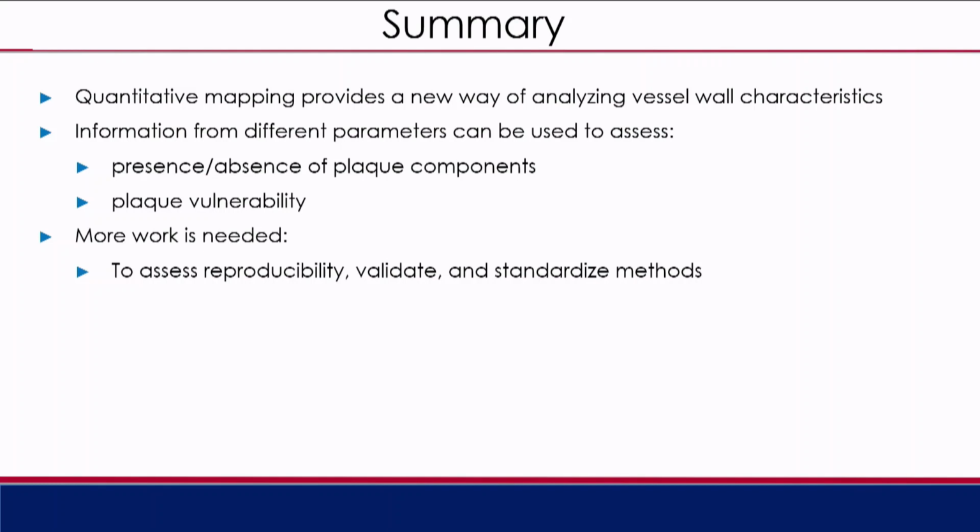The hope here is that you would have a technique that will acquire data that's quantitative. You can automatically segment the wall, or there will be a software that will do it and can actually classify the plaques without really the need of these very experienced radiologists to do it.